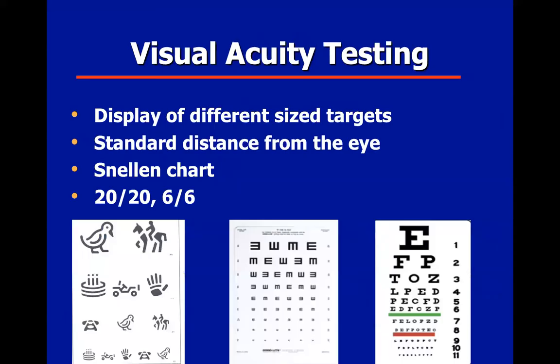So we're going to be talking a lot in our 5 lectures. I'll be presenting to you about visual acuity testing. So I just wanted to display these different testings. Of course, for us here in Saudi Arabia or in the Arab countries, because a lot of people might not know the actual letters, English letters, we use what we call the E. So we always tell them, where is it opened? Up, down, right, or left.